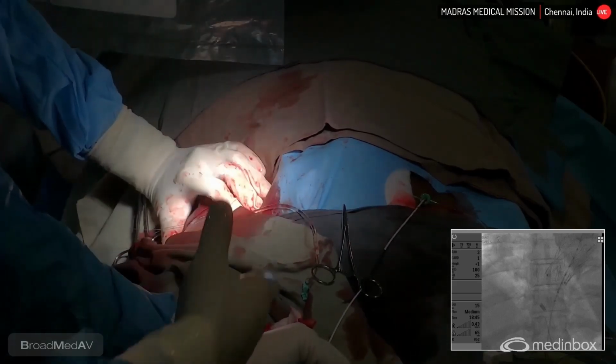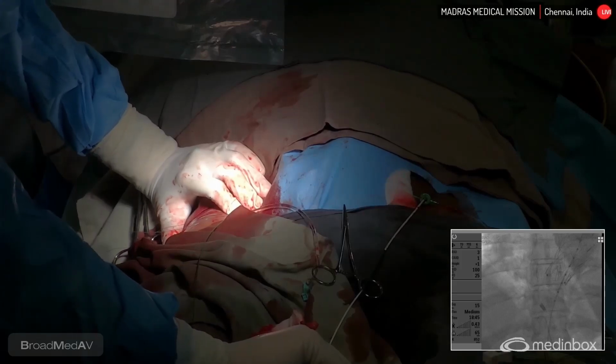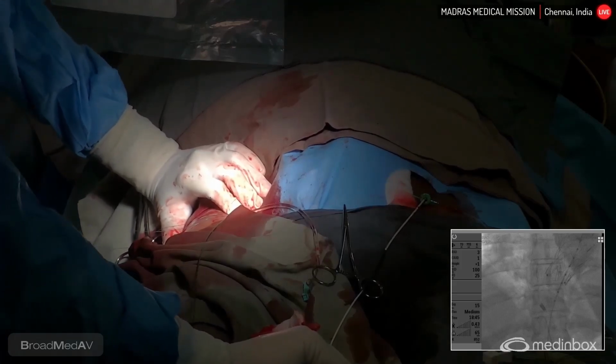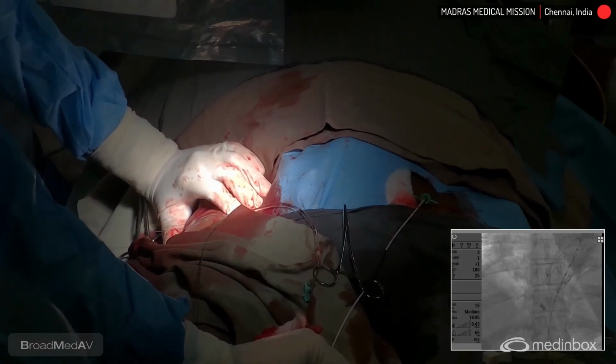What is the opposite iliac size? You give me a 10 millimeter balloon. 11 okay. Or 10 millimeter or even 11 balloon. 12 also we can take, sir. 10 or 11.